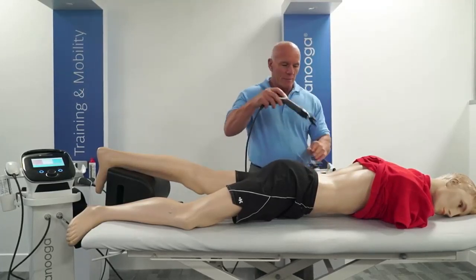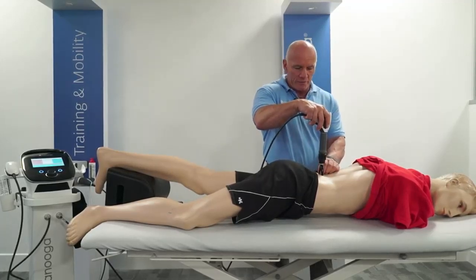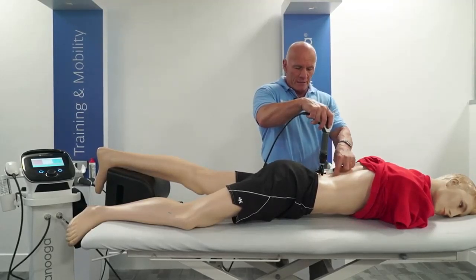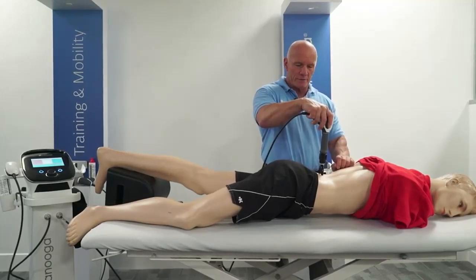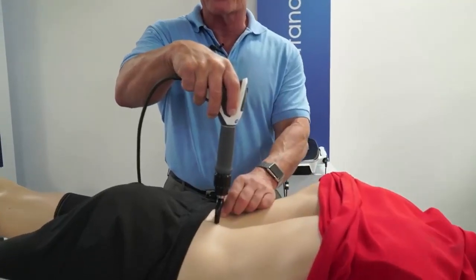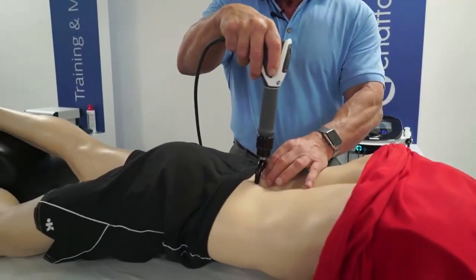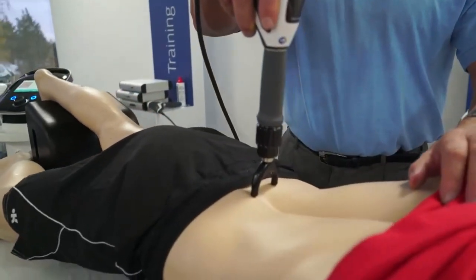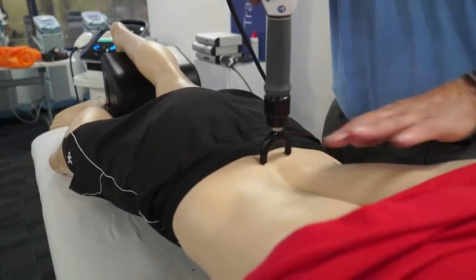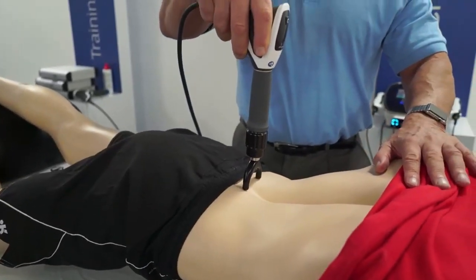Because now look guys, it fits very nicely across the paravertebral muscles. We're avoiding those spinous processes which, if you went over those with a radial pressure wave, would be extremely uncomfortable for the patient. Okay? So this works really nicely to get into that paravertebral tissues either side of the spinous process. Okay? So we use a gel. Obviously I'm not going to use gel on poor old Fred here, and we administer in the same way as we would our shockwave, but we keep this still now.